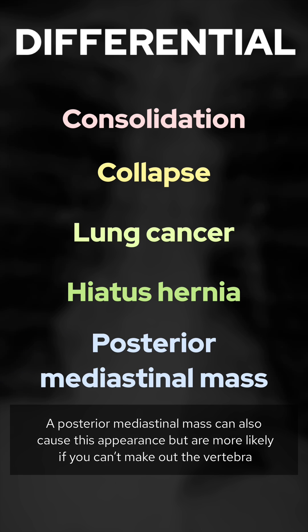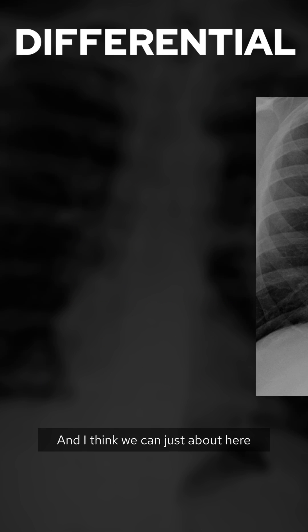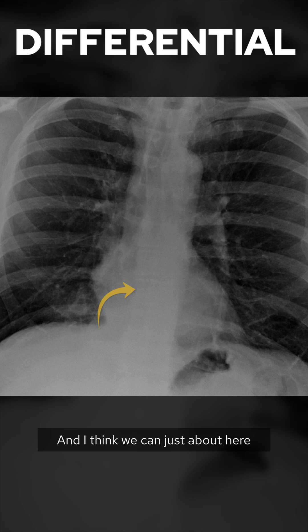A posterior mediastinal mass can also cause this appearance, but is more likely if you can't make out the vertebrae — and I think we can just about see them here.